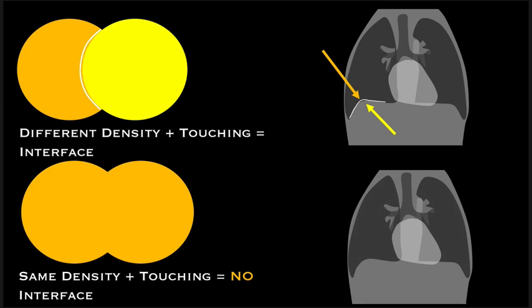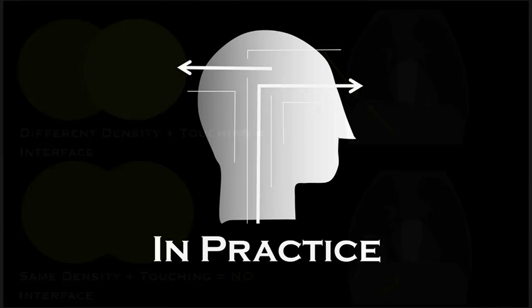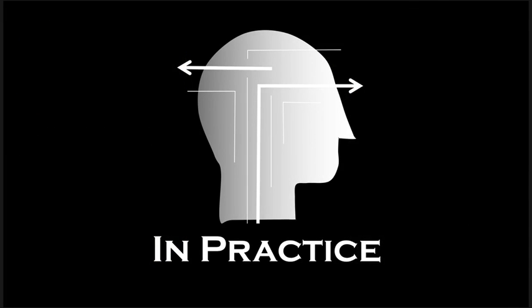So same cartoon chest here, this time with a pneumonia right there at the right lung base, and you can see that we've lost that interface. We can't tell where one starts and stops, so it would be blurred. Let's do a practical example of this.